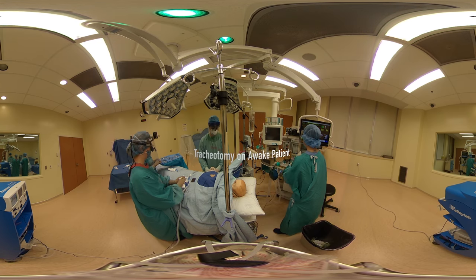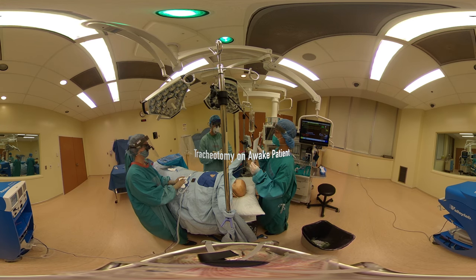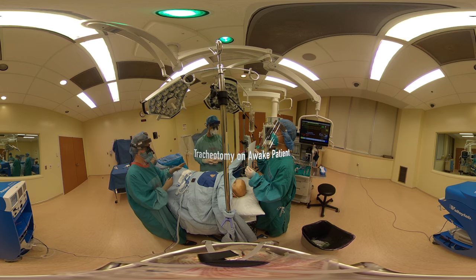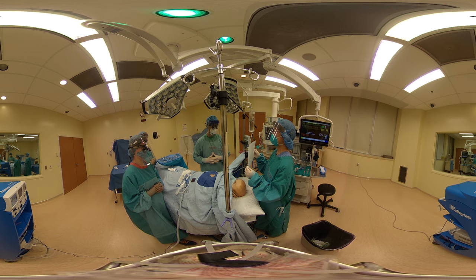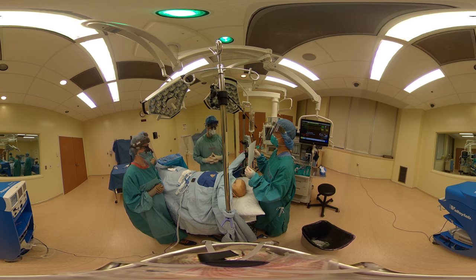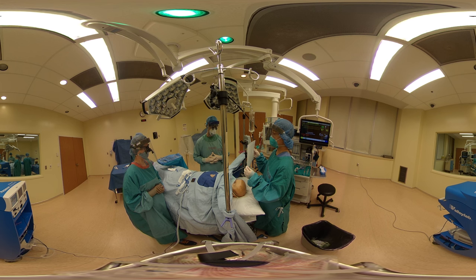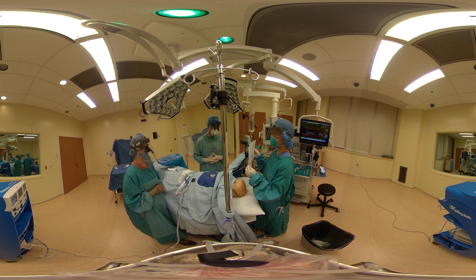We're going to do our time-out here. We've got patient John Doe here for an awake tracheotomy. He has an obstructing laryngeal tumor and therefore is not intubatable and needs an awake tracheotomy. He is a suspected but unconfirmed COVID patient.